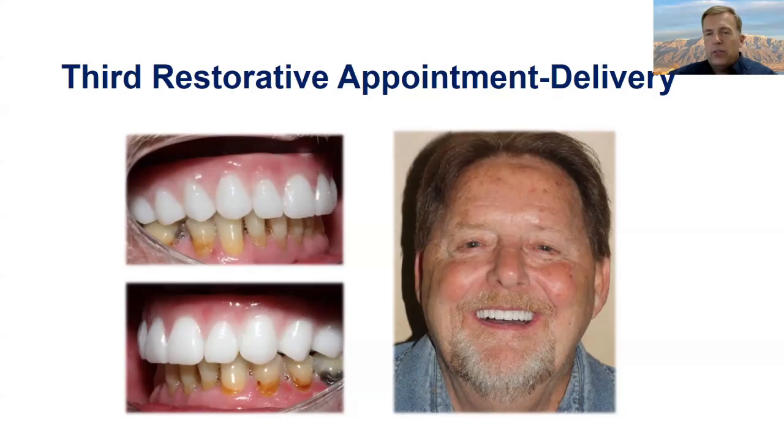Again, you'll do your Sheffield test and check all the stuff we talked about at the try-in. Make sure you have the right polishing kit for the type of material you're using, and polish things up before you deliver it, especially with zirconia. Rough zirconia can tear up the opposing. Polished zirconia is very, very kind to the opposing. So the polishing is a huge variable on those.